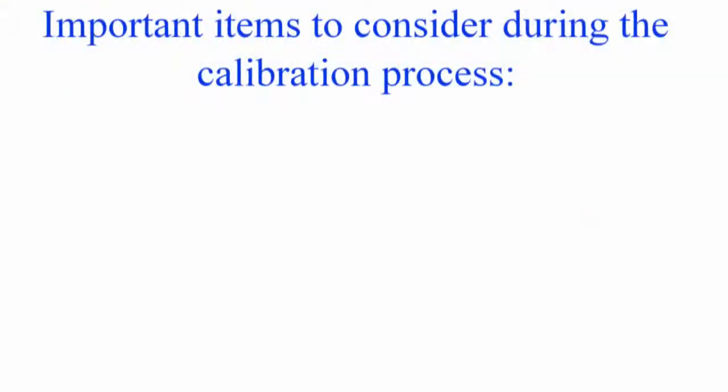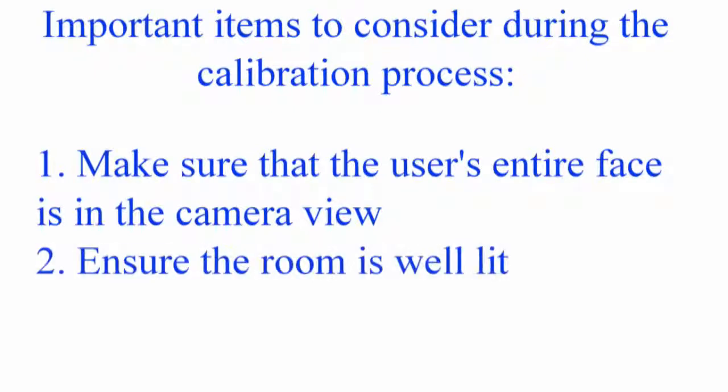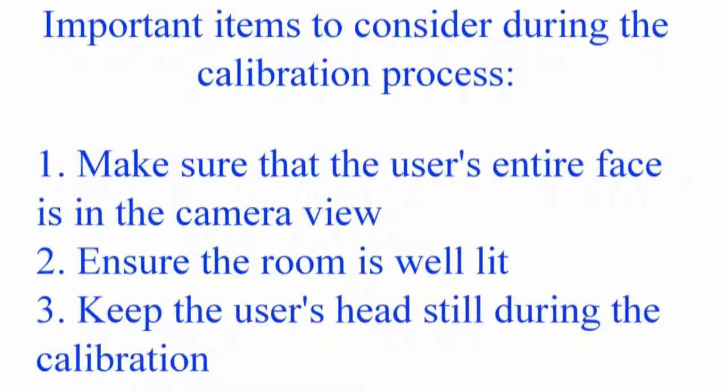Please note that there are 3 important items to consider during the calibration process in order for it to be successful. The first is to make sure that the user's entire face is in the camera view. Second, ensure that there is good lighting in the room. And third, keep the user's head still during the calibration.